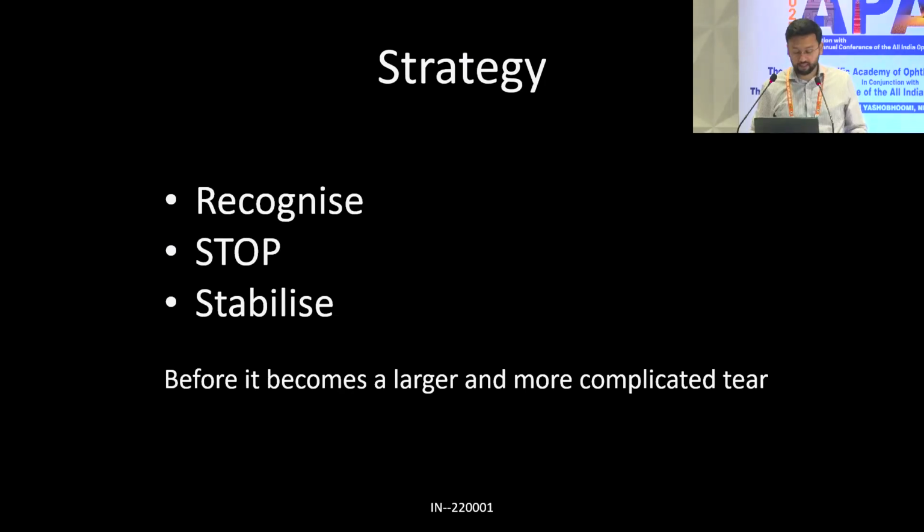There are some signs like sudden deepening of the anterior chamber, some sudden change in pupil size, especially during hydrodissection, which is called the snap sign, where there is pupil constriction, and abnormal tilting of the nucleus, abnormal behavior of the nucleus following the phaco tip.